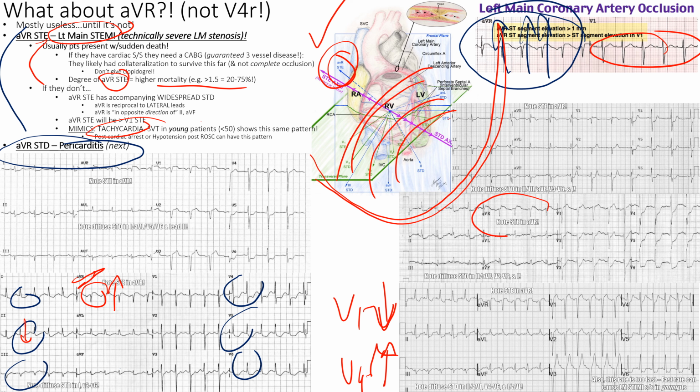Okay, so this ST elevation in AVR right here. Look at this profound depression. If I had that profound depression in V1 through V3, I'd be thinking of what kind of STEMI? Not right side, but, yeah, something that the RCA feeds. Posterior wall MI, right? If I see V1 through V3 ST depression, I'm thinking of posterior wall MI, right?